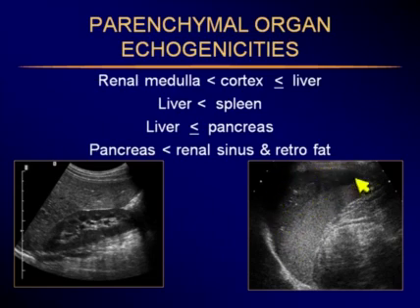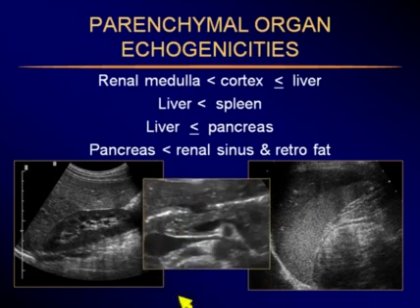This is the left lobe of the liver going all the way across to the left, hugging the spleen, so that it looks like it's a part of the spleen, and it isn't. So this is liver, which is indeed less echogenic than spleen. And this is not to be mistaken for a subcapsular hematoma. Sometimes this is mistaken in the spleen. So there's our proof. Now, the liver is also less echogenic or equal in echogenicity to the pancreas.